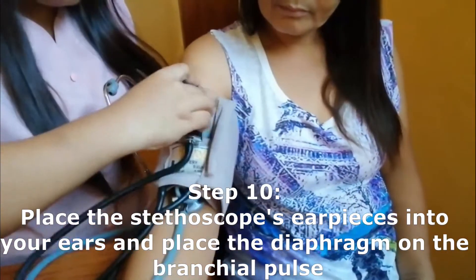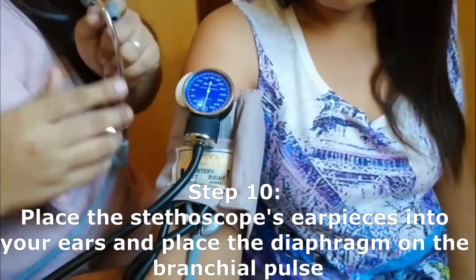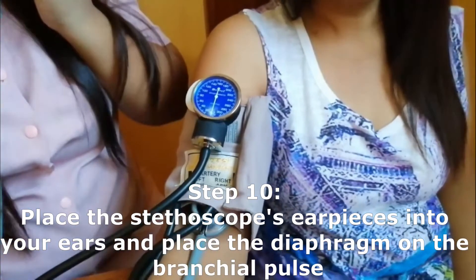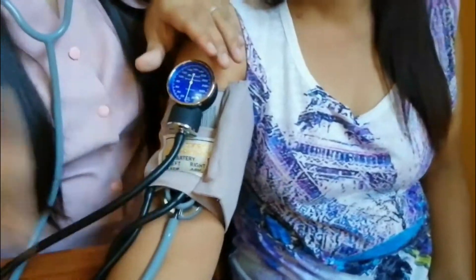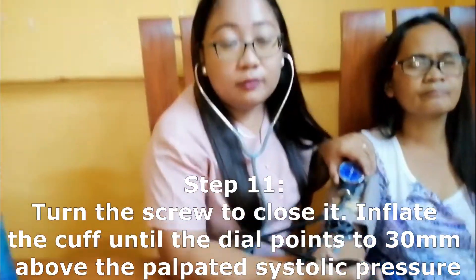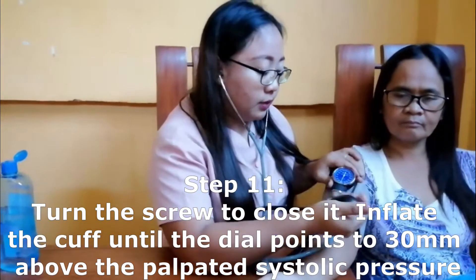Place the aneroid gauge so you can easily read the blood pressure measurement. Next, inflate the cuff using the bulb, inflating until 180 to 200 millimeters of mercury.